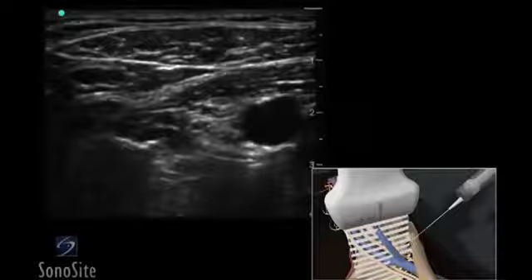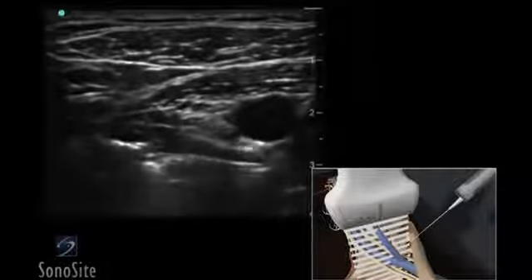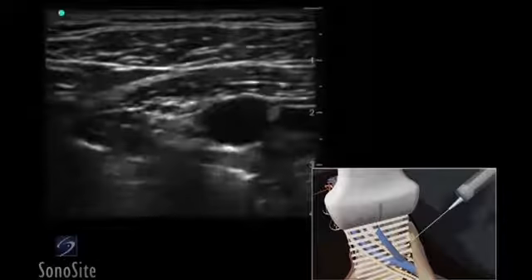The spread of local anesthetic should be observed. Supplemental injections can be made anterior to the artery to deposit local anesthetic around the lateral and medial cords if required.